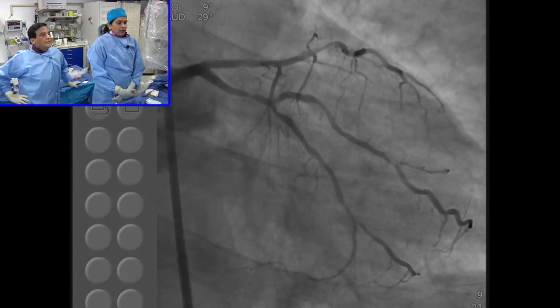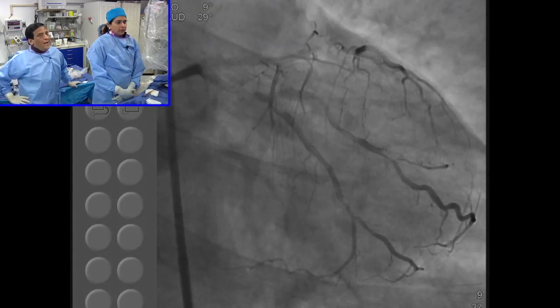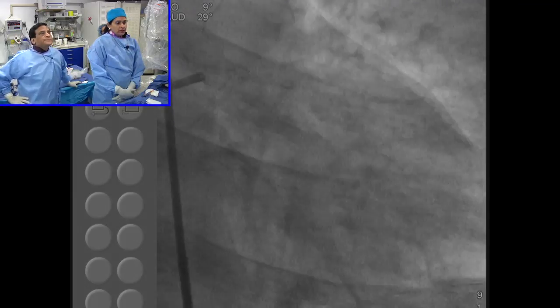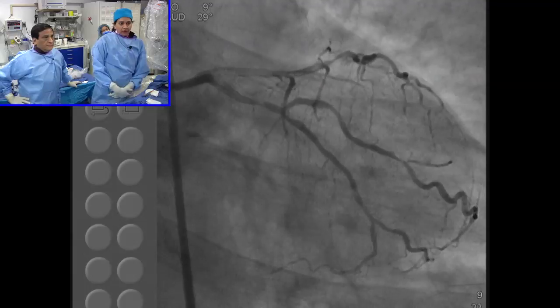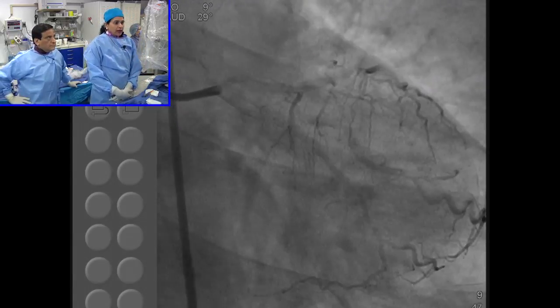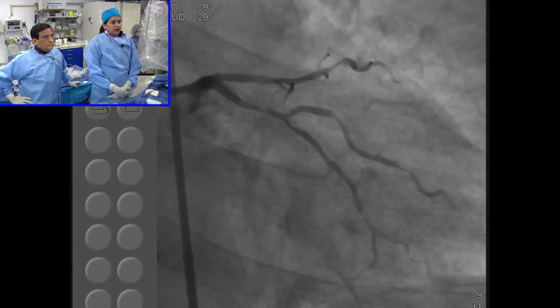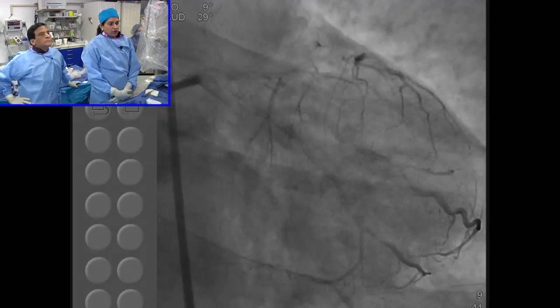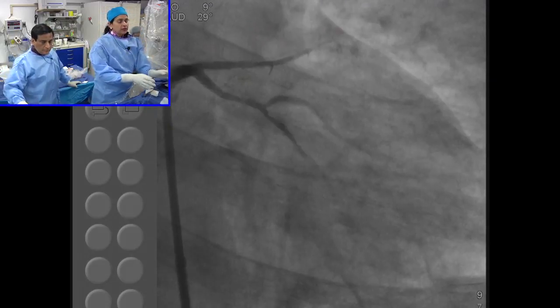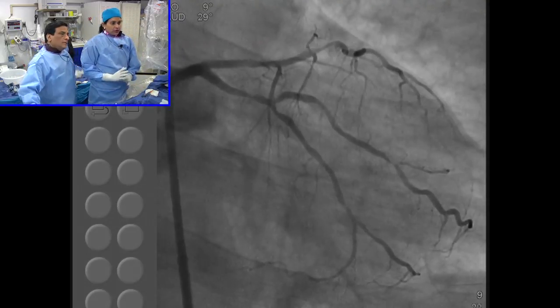Okay. And then coming to the bifurcation itself, if you start proximal circ going into OM1, you need a long stent, since there is a moderate disease after the bifurcation which you need to take care of. So I think one long stent will take care of that. Question is, do you just want to balloon the distal circ and consider stenting across, or you just have to decide that once you take care of the distal circ with PTCA. Then, are we with a 7 French guide?